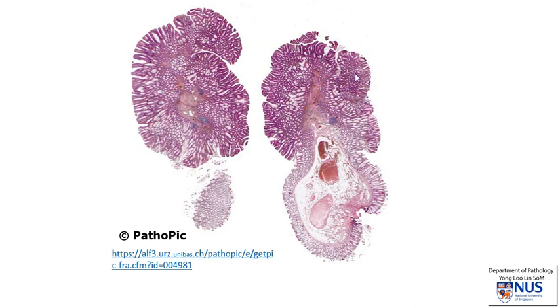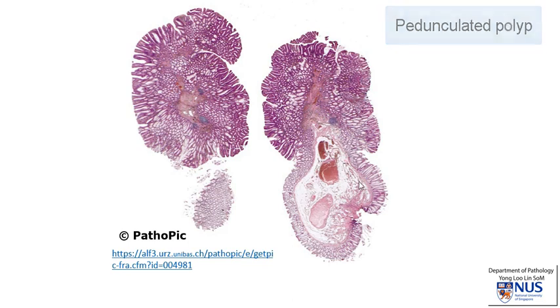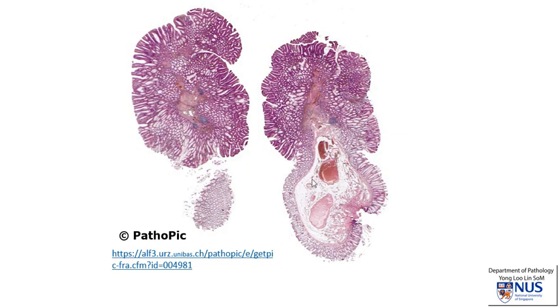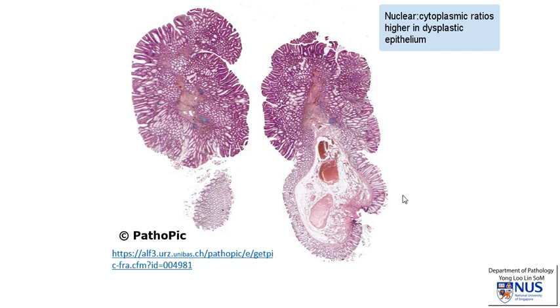Here is an example of a very low-power microscopic view of a pedunculated polyp, taken from PathoPic, which is a wonderful resource that allows us to show histology and gross pathology pictures. Here is the stalk of the polyp, and this part here is the cauterized base of the stalk. This is the benign or normal colonic mucosa, and this is the submucosa, which contains some loose connective tissue as well as some congested blood vessels. The head of the adenomatous polyp is in this region, and the mucosa is a lot darker than in the normal colon because the nuclear cytoplasmic ratios, or NC ratios, of the dysplastic epithelial cells are much higher than the normal colonic epithelial cells.